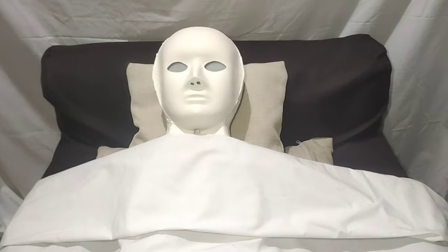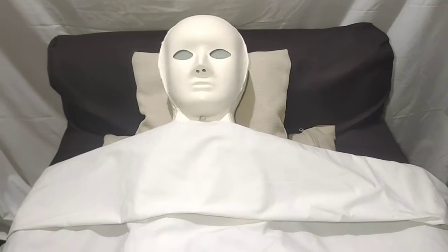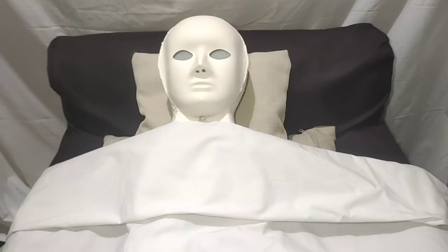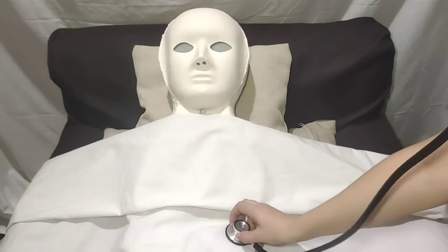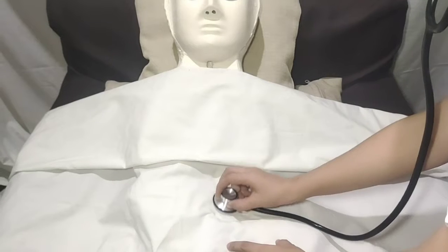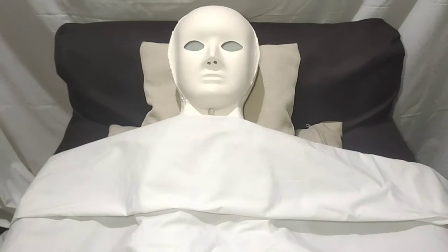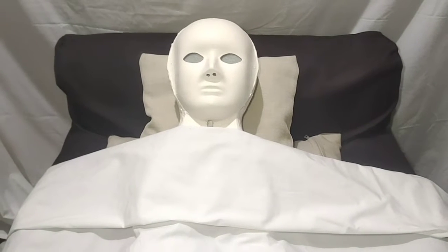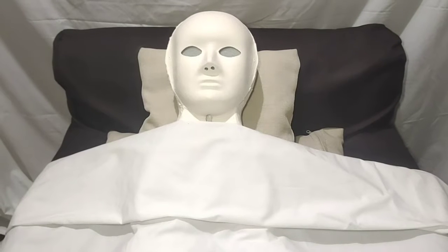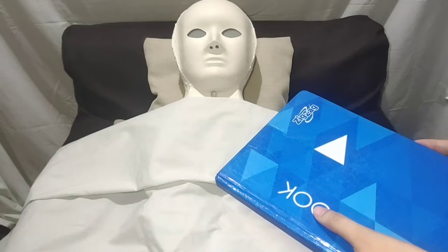Ma'am, I am going to inspect your stomach before the nasogastric tube insertion procedure. As I palpate the abdomen, it is soft, with no distension, no pain, and no masses palpated. Okay. After the assessment, let us now proceed with the implementation.